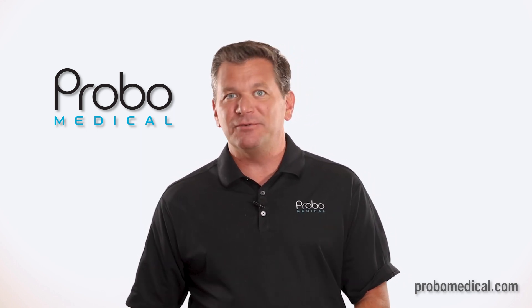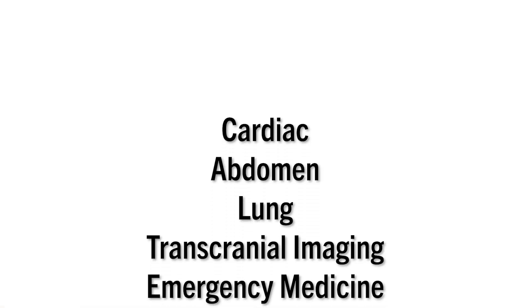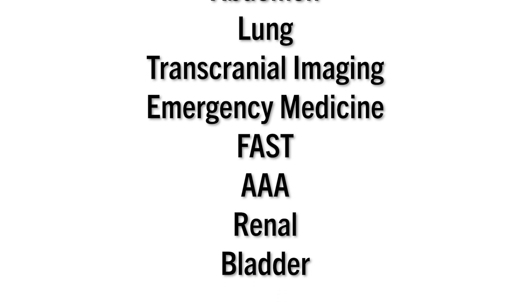The TE Air is designed for specific point-of-care exams, most notably cardiac, abdomen, lung, transcranial imaging, emergency medicine, FAST exams, AAA scans, renal, and bladder.